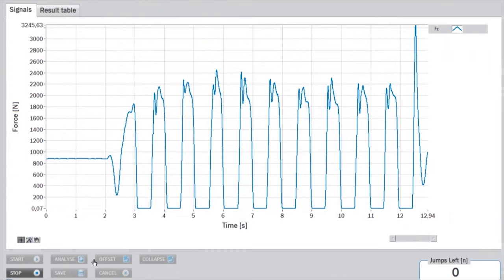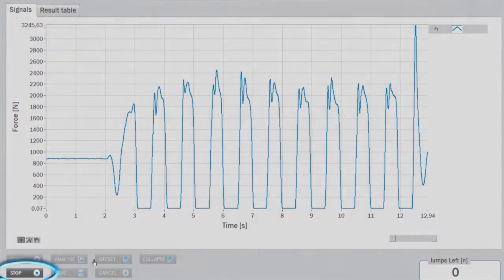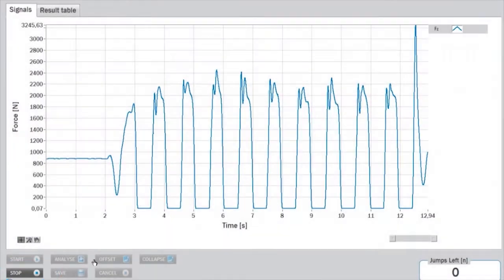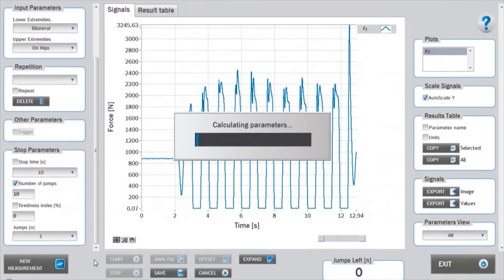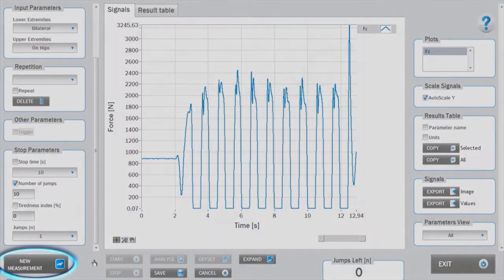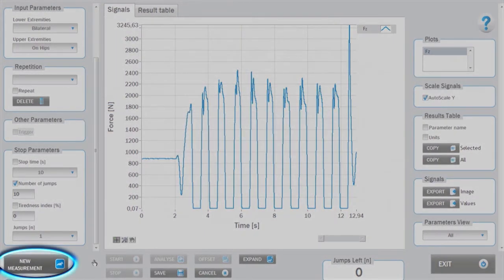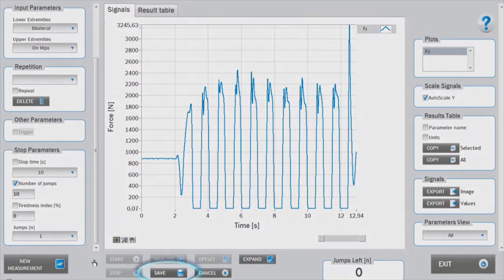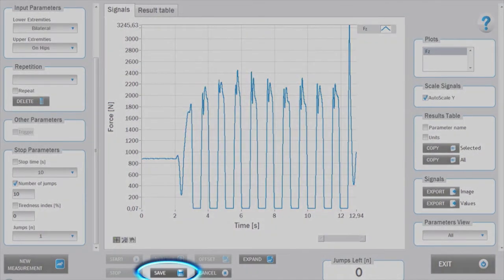The measurement stops automatically after completing the task. It can also be stopped manually by pressing the stop button in the lower panel. The measurement can be repeated by clicking on the new measurement button and not saving the previous repetition. If you are satisfied with the measurement, you can save it.